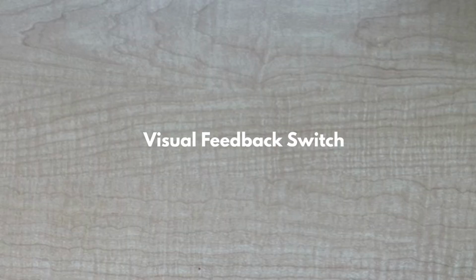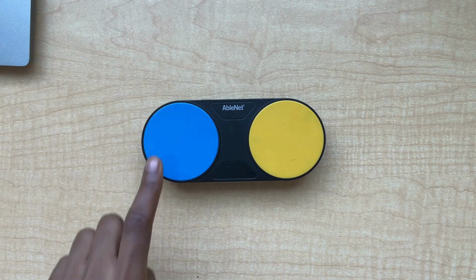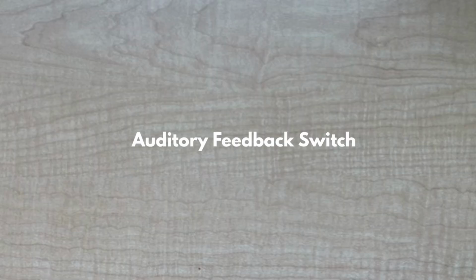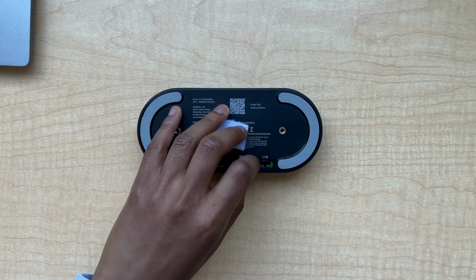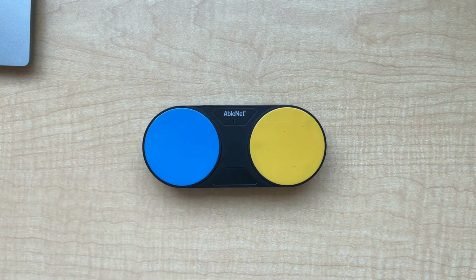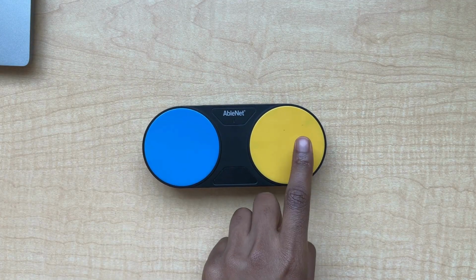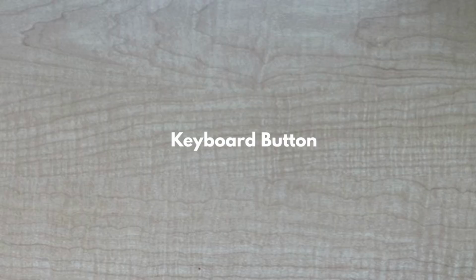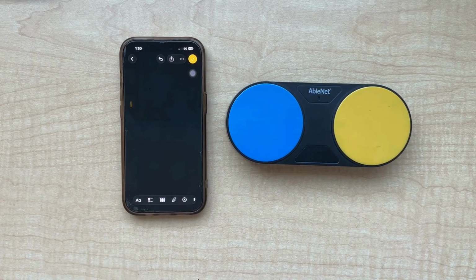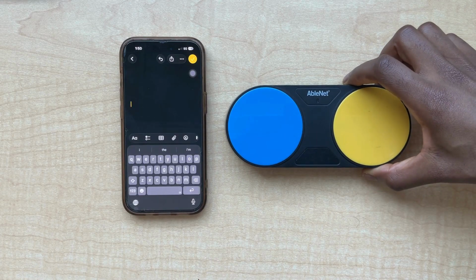Visual feedback switch. The visual feedback switch causes the buttons to light up when tapped, making them easier to see. Auditory feedback switch. The auditory feedback switch plays a beeping sound whenever a button is activated. Keyboard button. With compatible devices, the keyboard button on the top of the Bluetooth can be used to hide or unhide the on-screen keyboard.